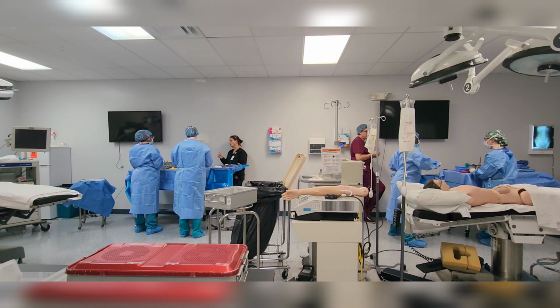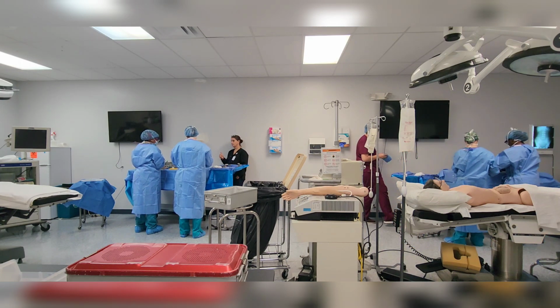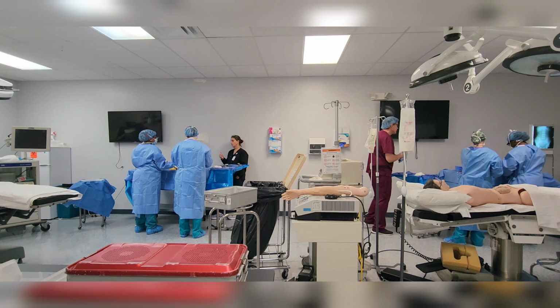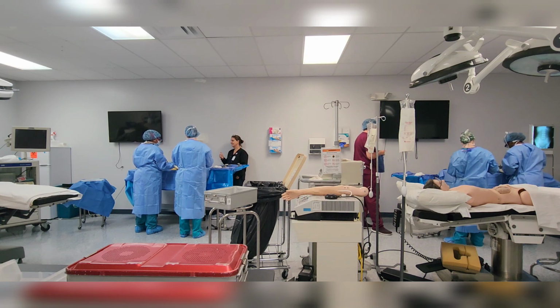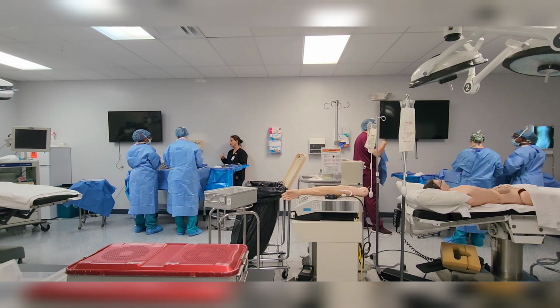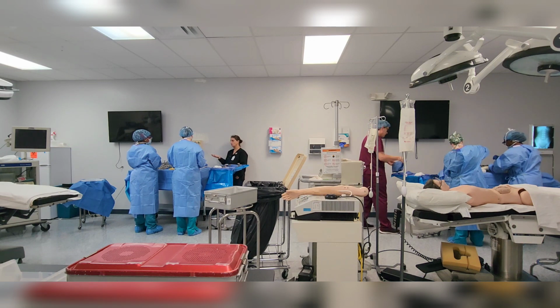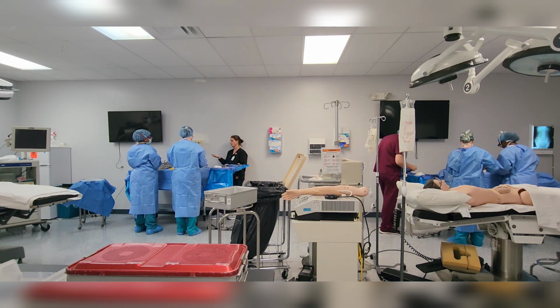What do you think our next suture is going to be? What is it? Vicryl? Correct, so probably a small Vicryl. I'm going to put a little Vicryl through here. Then what do you guys figure we're going to need at that point? Then we're going to go through the layers. You can start putting some items here on the layout. They're going to probably do a couple of layers of Vicryl, and then do the skin. What do you think they use on skin? If you're not sure, I can let you know.